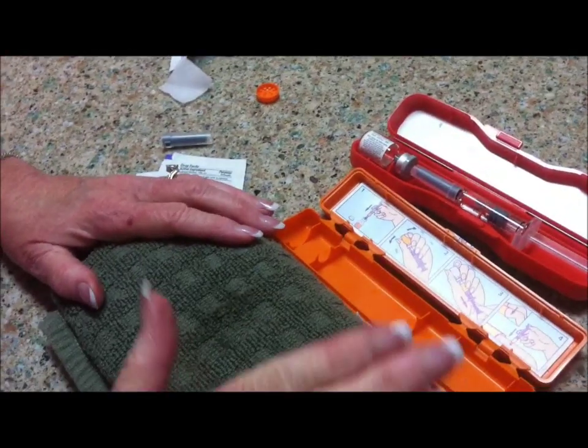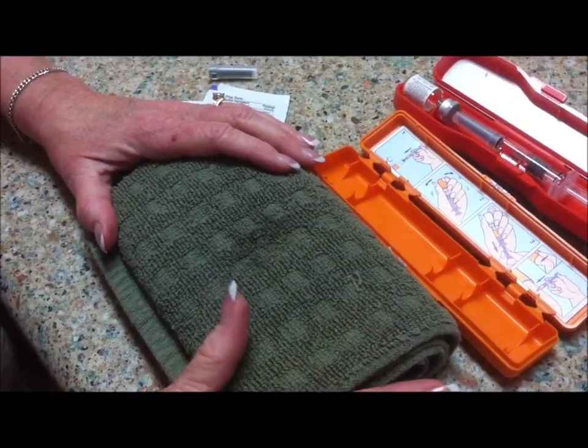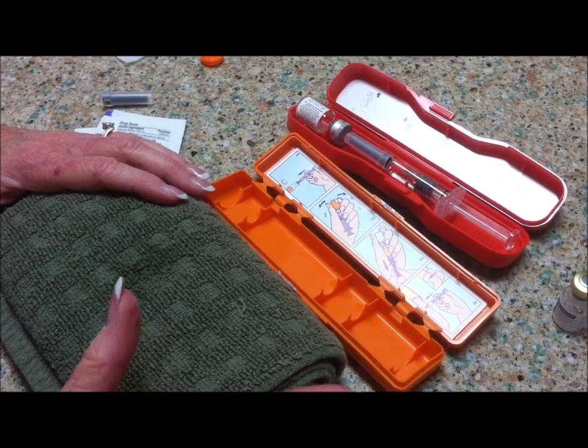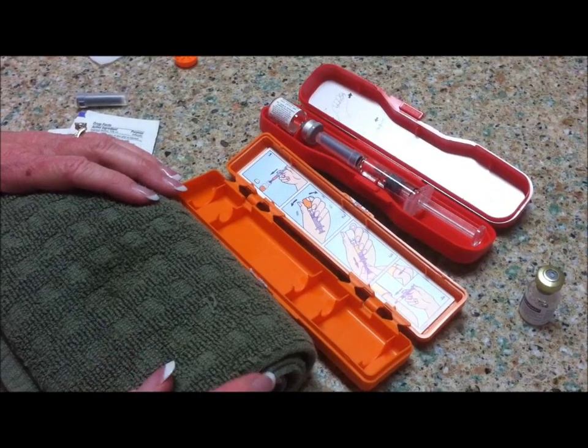This concludes the use of the glucagon emergency kit. For any further advice, you should talk to your health care provider. But it is important to have a backup glucagon emergency kit just in case of emergencies.